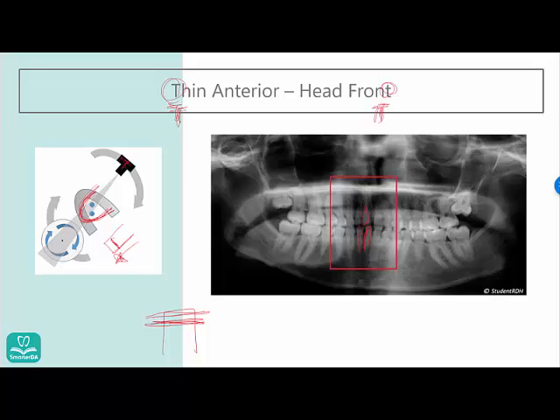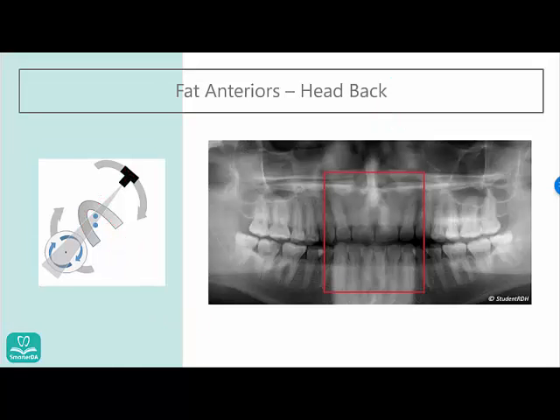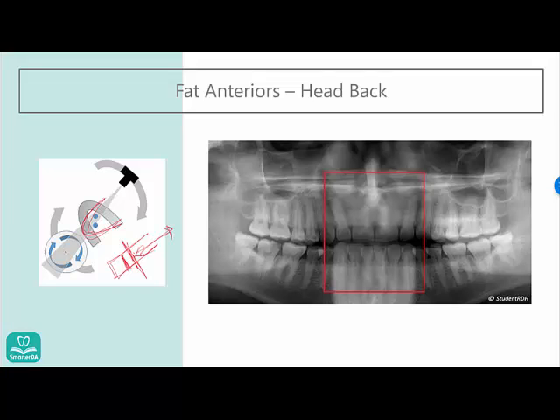The opposite happens when the patient bites too far back. If the patient bites behind the notch, the anterior teeth get closer to the camera, which makes them look bigger — those are called fat anteriors or large anteriors. Memory tip: the A in 'fat' and the A in 'back' — match those. So you have fat anteriors when the head is too far back. That covers the four errors we reviewed today for the panoramic radiograph.